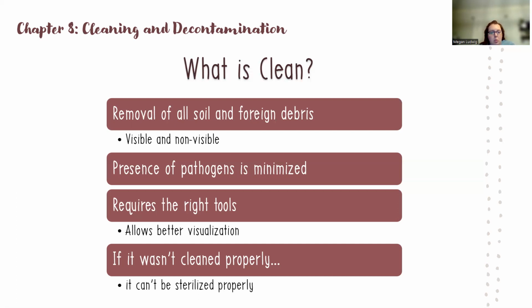You have to do it with the right tools to make sure it's considered clean. And if it wasn't cleaned properly, then it can't be sterilized properly. If you didn't clean it, maybe you had that hinged instrument shut, it didn't get left open, then it can't be sterilized properly. It negates the whole process and it has to be done again.